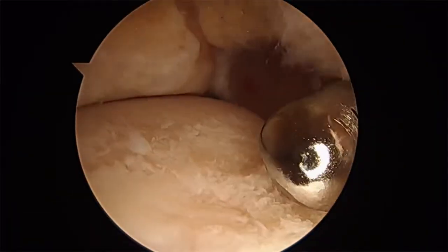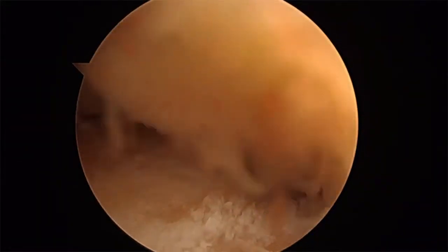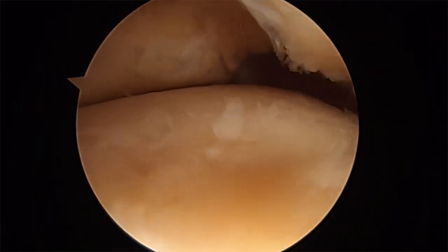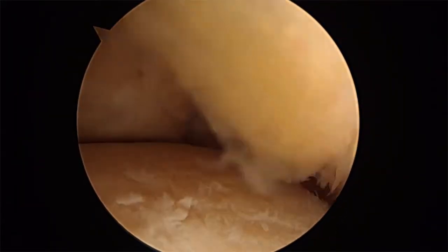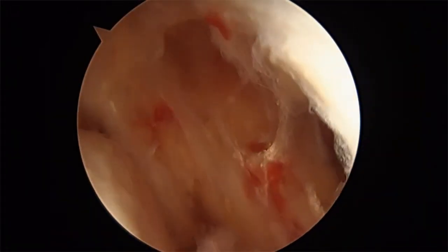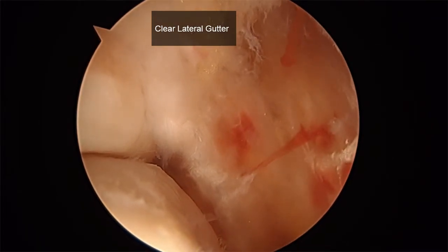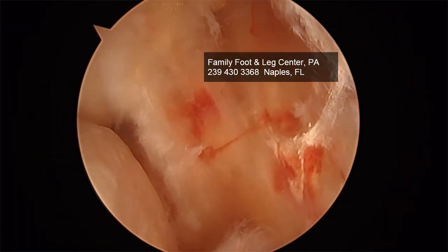I'm going to send a shaver to the anterior neck. Range of motion looks good. Again, we're going to inspect the gutter. And the lateral gutter impingement is gone. Capture image.